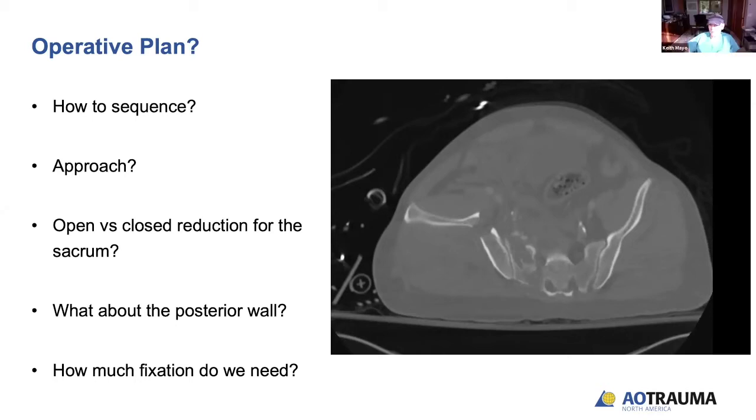I think it just has to do with the fact that because of the zone 2 comminution, you might be close, but you might still have a significant malreduction. And if then the intact innominate bone is malpositioned relative to the anterior and posterior columns, then you have an obligatory default to, if you're lucky, surgical secondary congruence, which is probably where you're going anyway.